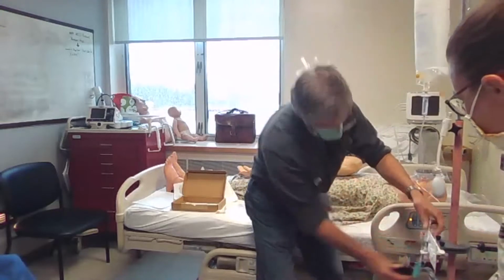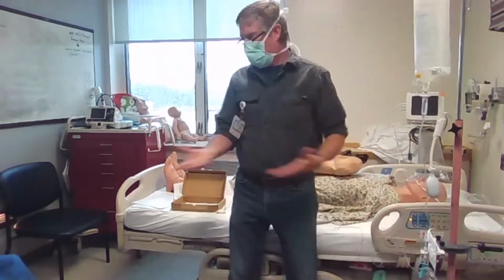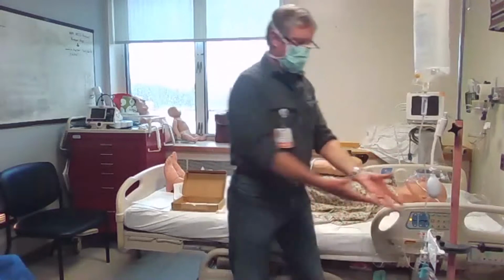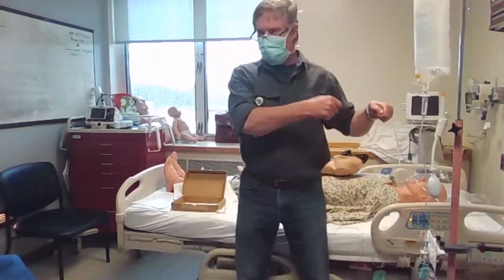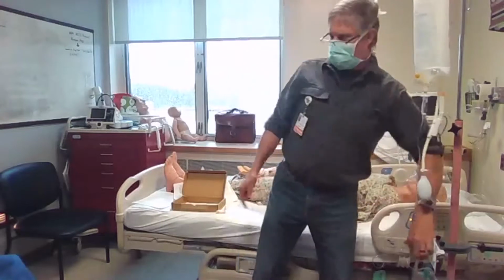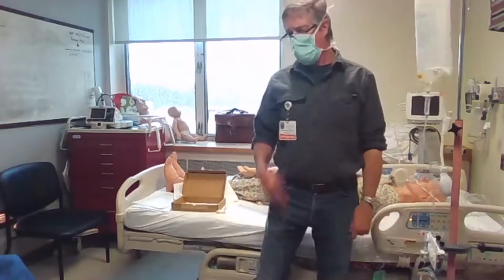But the thing I don't like about that is, when the patient moves, or the bed moves, anything like that, then you've got to re-zero it, or you've got to move it. But if the patient's up higher, just because you move it up higher doesn't mean you're back at the right pressure. This is reading 10 centimeters below where you just were, so it's going to give you a false read.